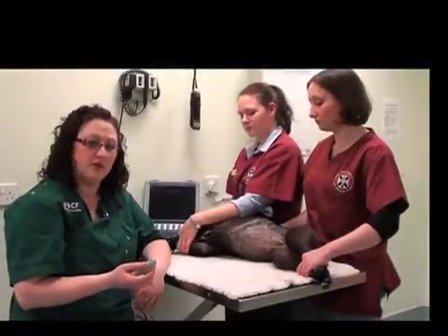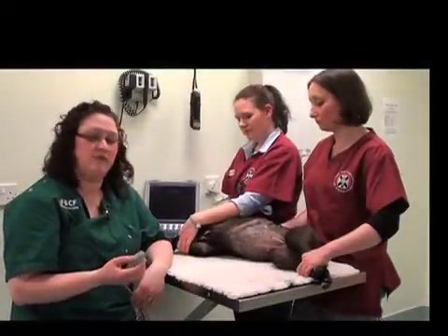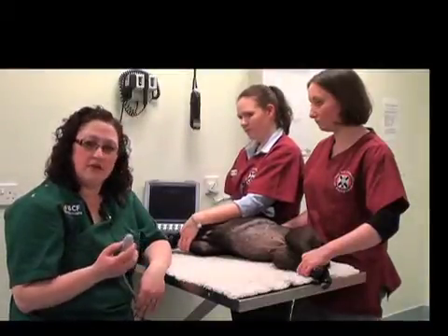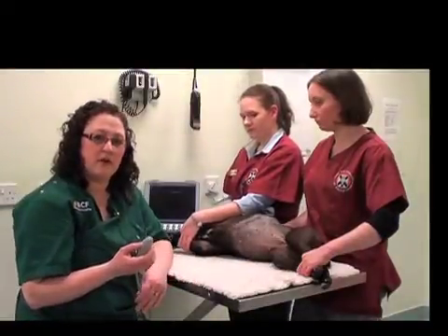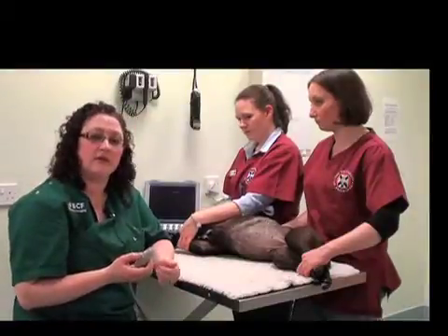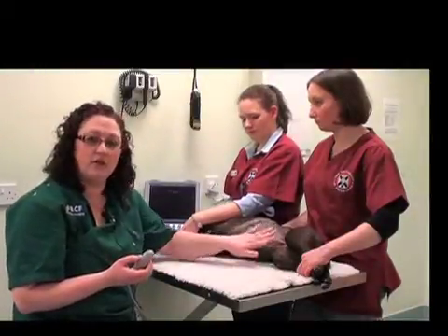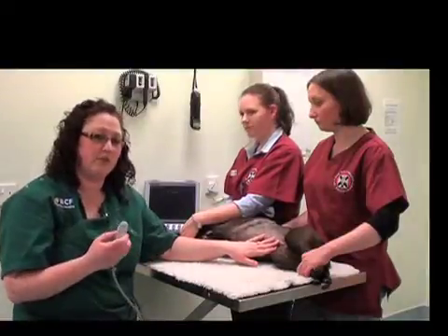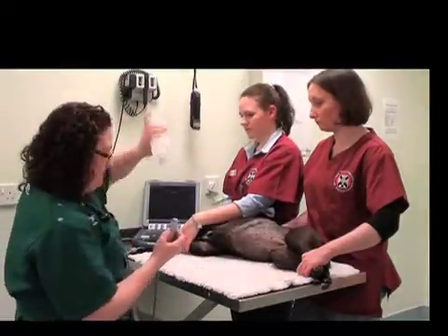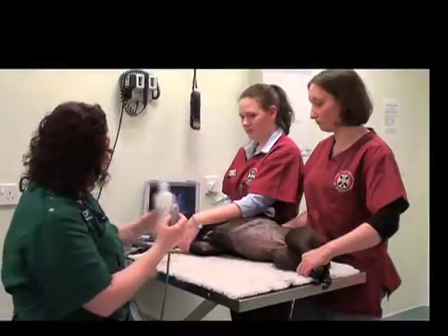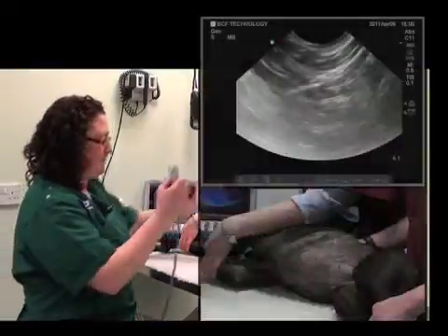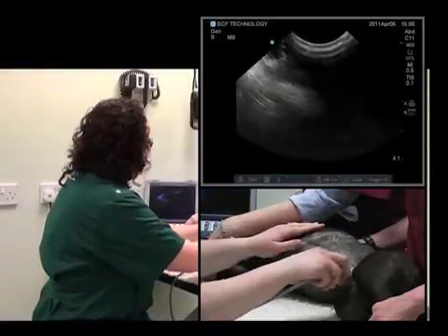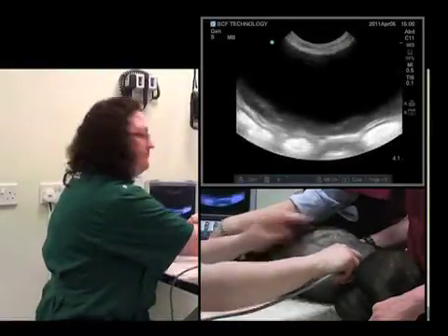The next organ that we'll interpret and find is the bladder, the urinary bladder. This is located exactly where you would expect to perform a cystocentesis or a manual expression — in the caudal midline of the abdomen. We'll add a little bit more gel before we go and do that, and there it is.